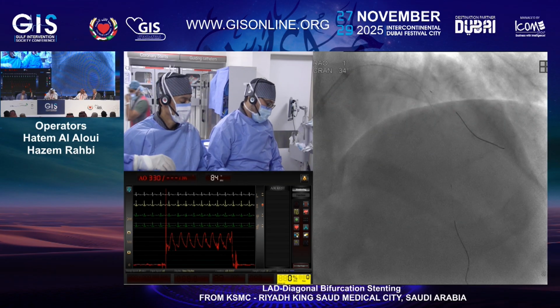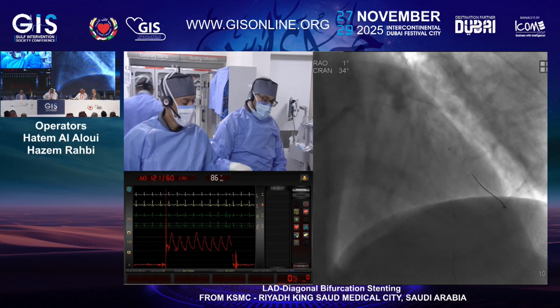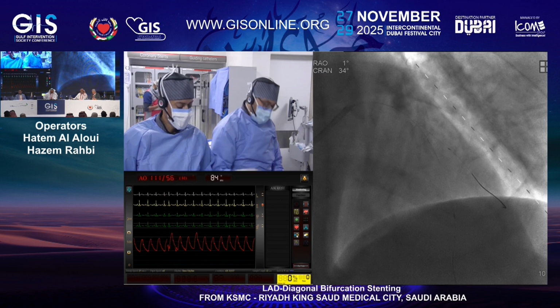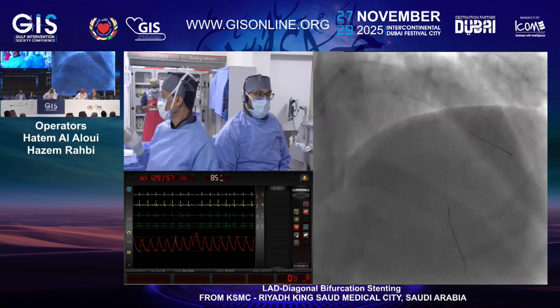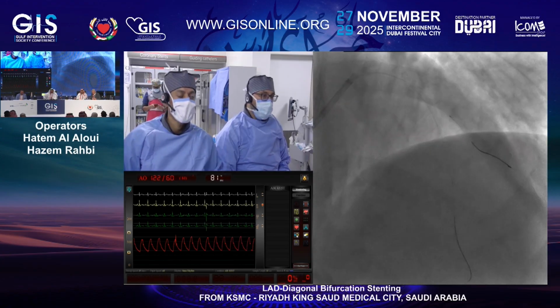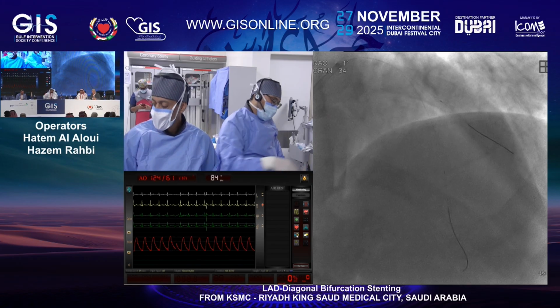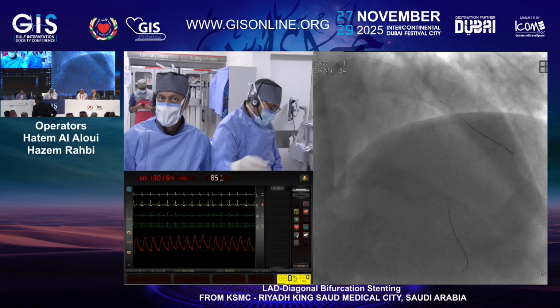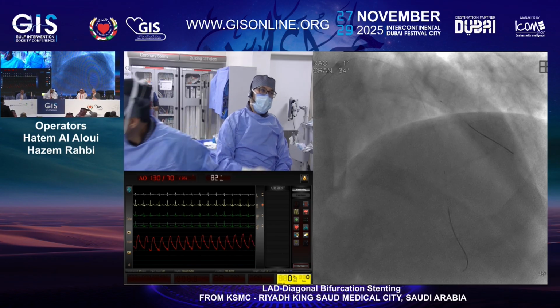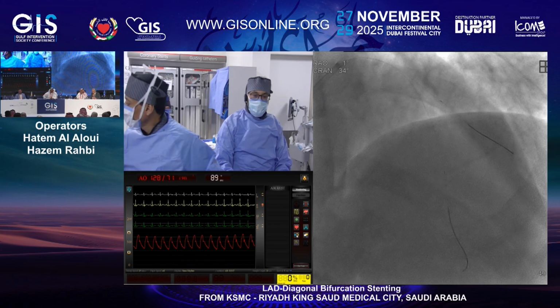So what kind of DCB are you planning to use, or it doesn't matter for you? I would use the Selution here actually. It doesn't matter too much, probably just if we take some results of some new trials. Technically here it doesn't matter. If it would be something difficult to cross, as you have said, if I was planning to do it after main branch stenting, I would choose a DCB that has a good crossing profile and a good trackability.